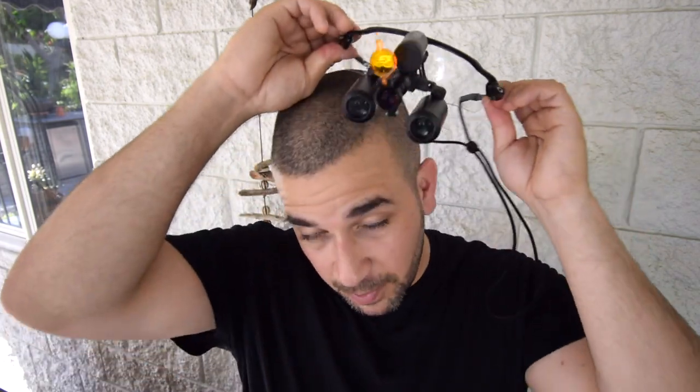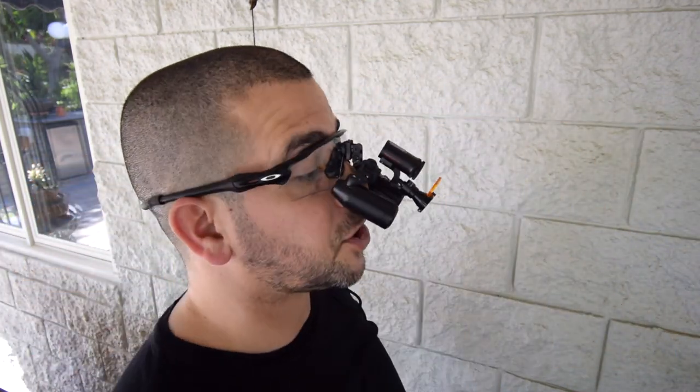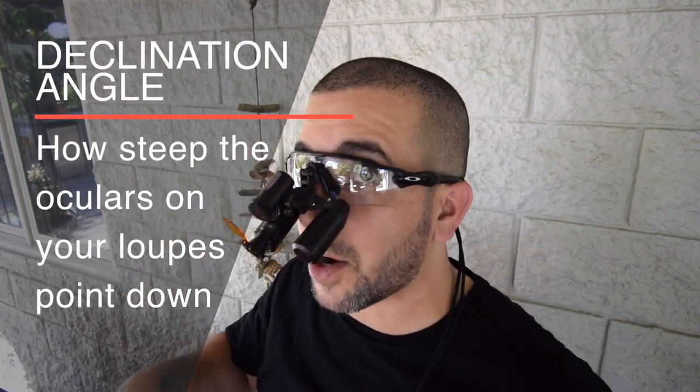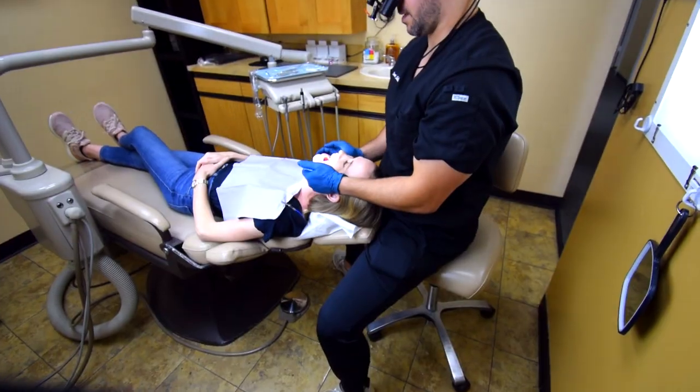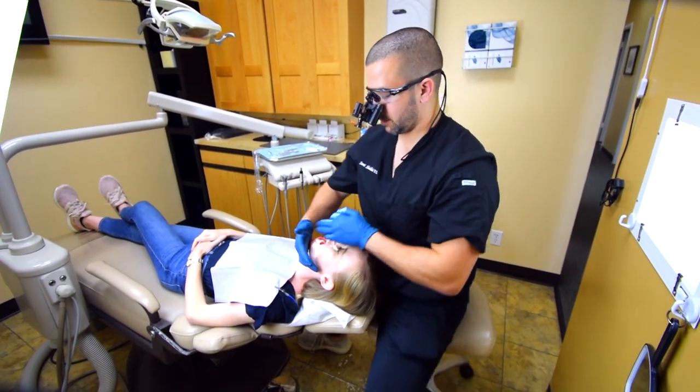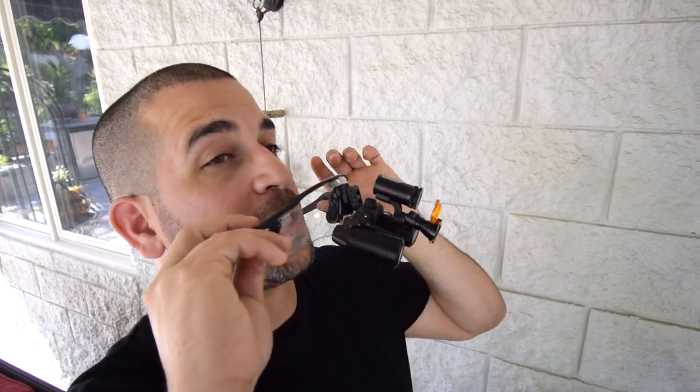What makes these loops stand out in the ergonomic space is the very comfortable, lightweight frames as well as the steep declination angle. Declination angle represents how steep the oculars on your loops point down. A steep declination angle is important to prevent unnecessary head tilting, which can cause musculoskeletal pain like the neck pain I was having earlier this year. The front lens mounted design allowed Surgitel to provide a very steep declination angle.